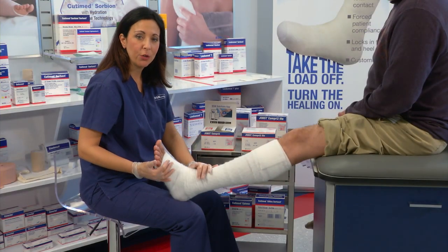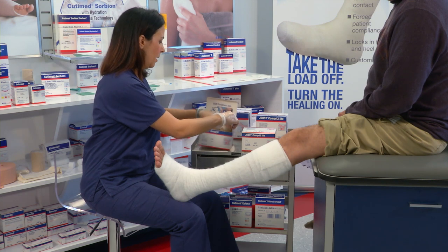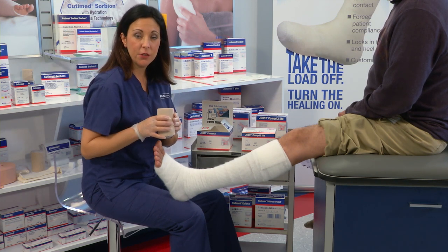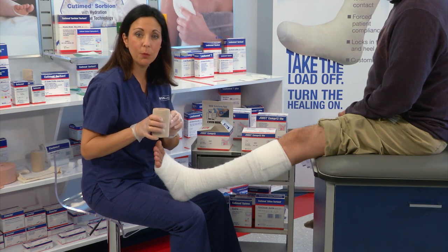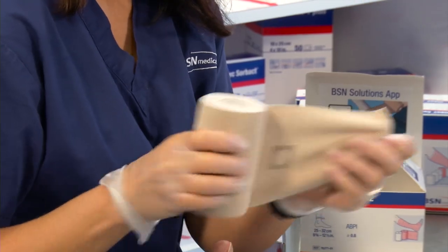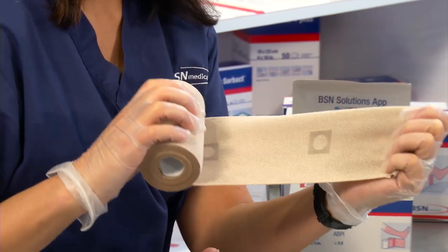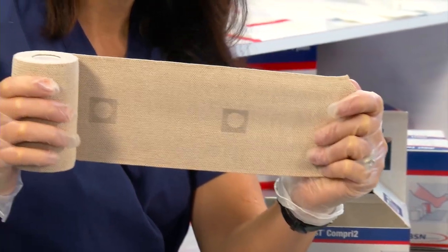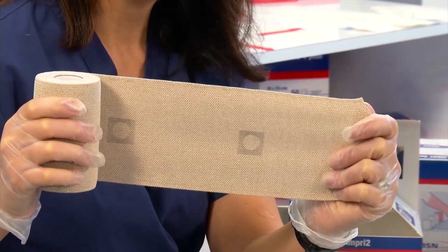Next, we're going to apply layer number two. Layer number two is a short-stretch cohesive bandage to provide reliable, consistent compression. As you can see, there's an indicator on the bandage which is shaped as an oval. When you stretch it and it becomes a circle, you know that you have the proper compression.